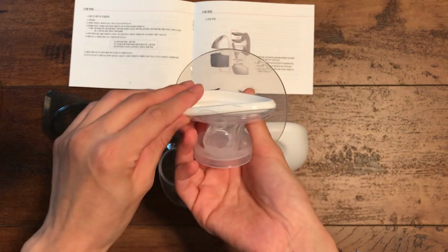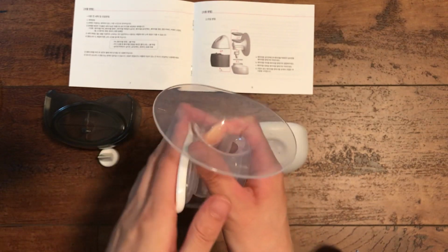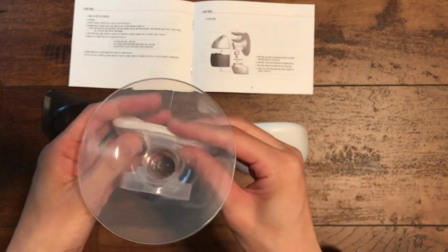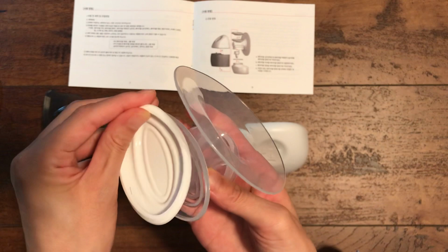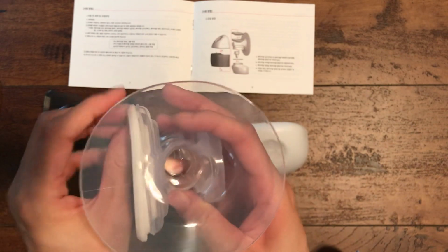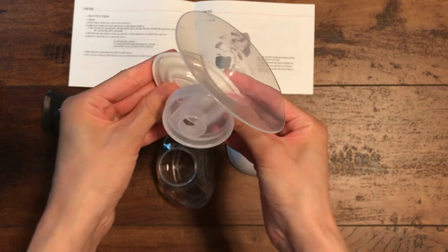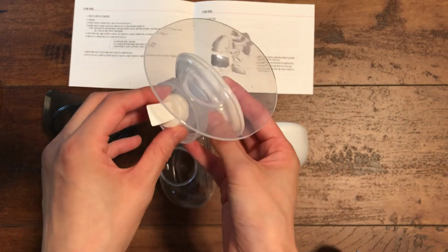So these are the white parts. Excuse all the hair. This is pretty easy to put in. Just push it in together. Okay, and honestly you can put this in later, but you can just go ahead and do that.